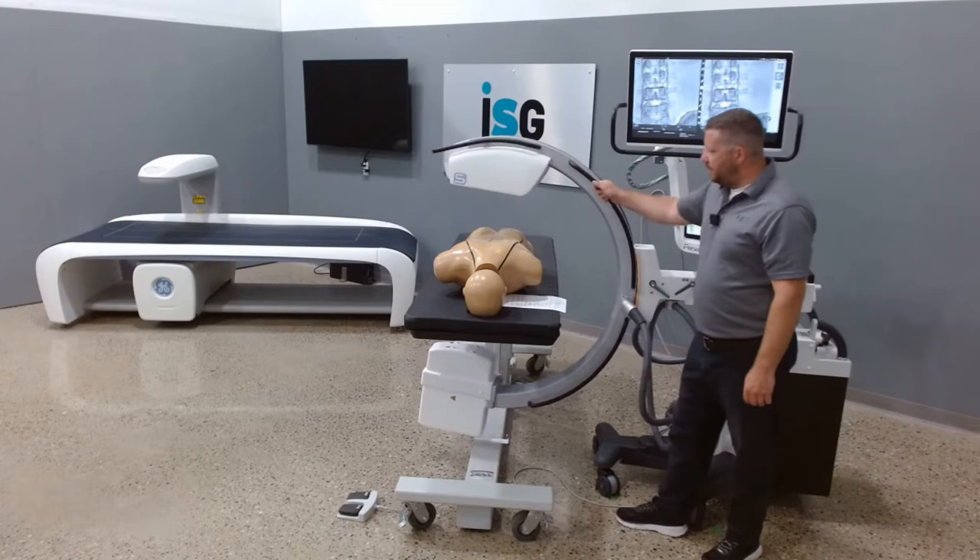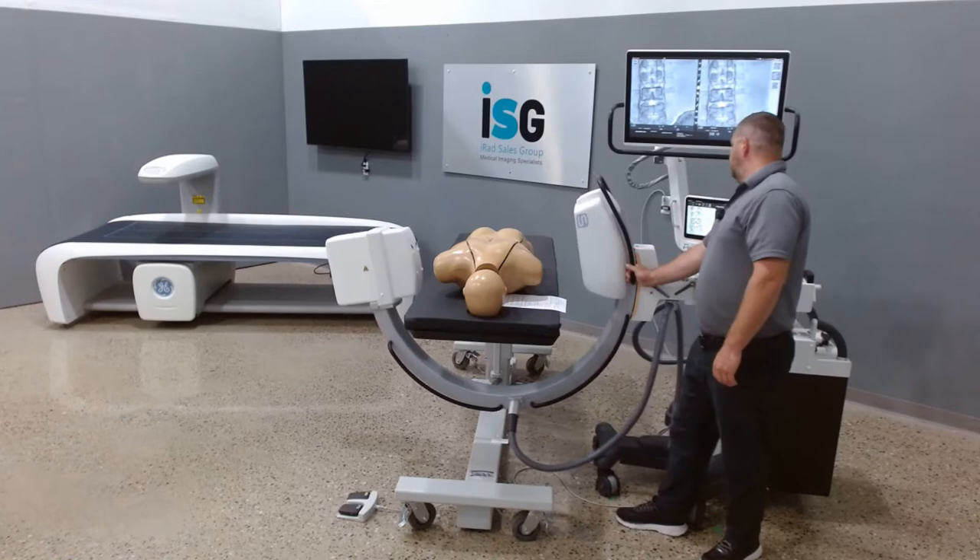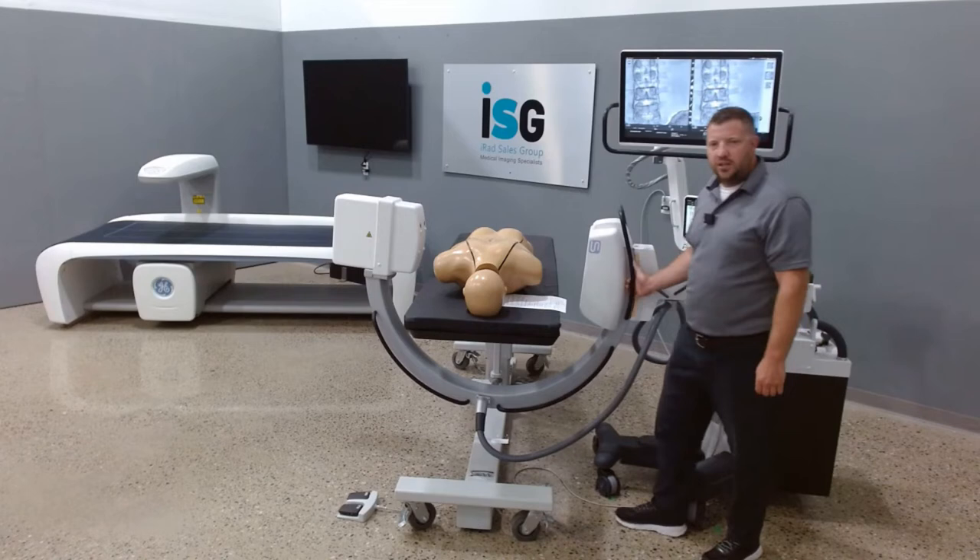I'll show you — most C-Arms are 90 degrees, which is here. And then we can go to 95 degrees. So you see that extra five degrees — a nice option.